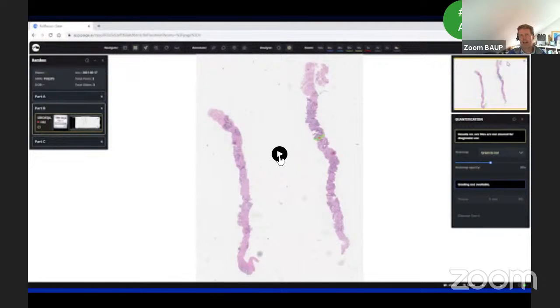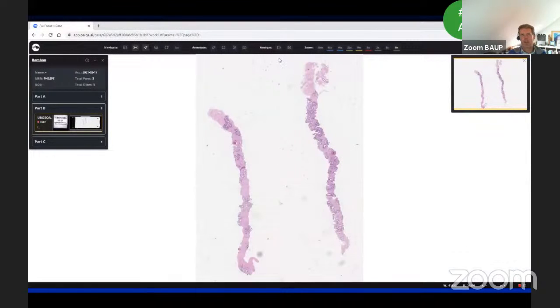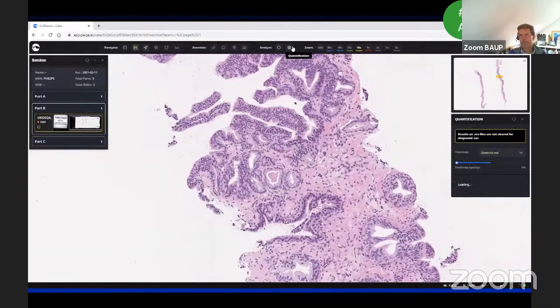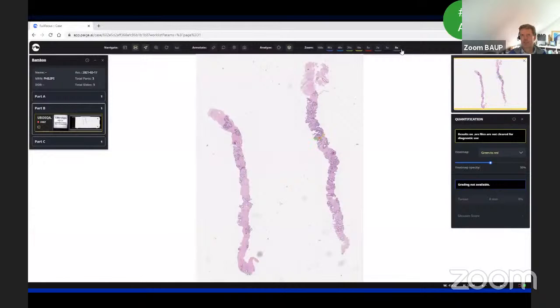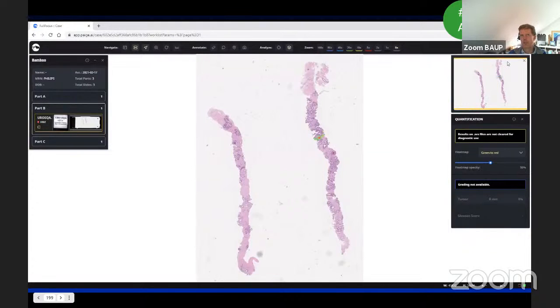So let's show you the AI. This is incredibly impressive. This is what you want in your background, because I must admit I thought it wouldn't be able to find it, but lo and behold, it has gone straight to that area with those couple of glands sitting there. Because there is so little tumor there, it said grading was not available. Or tumor, should I say, PIN-atypia, because we didn't want to call it tumor. So that's how AI could help you in the background. There's nothing else in the core, just that focus it picked up.